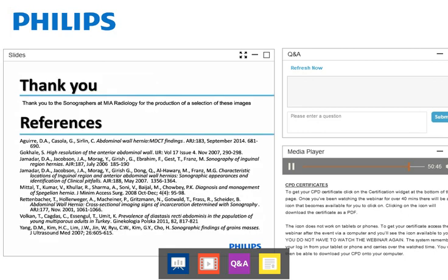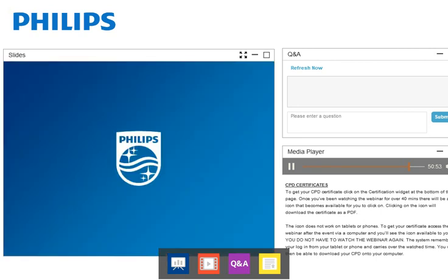Okay, so we've had a few questions come through here. Let's have a look. Do we have a question here from Cheng Yo from MIA? And the question here, is it important to measure the hernia defect? Yes, it is, because that can help the surgeon know whether surgery needs to be planned immediately or later.